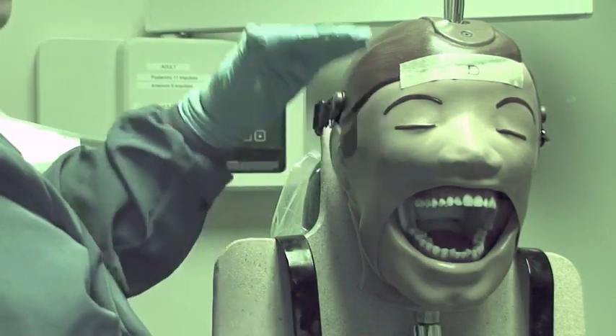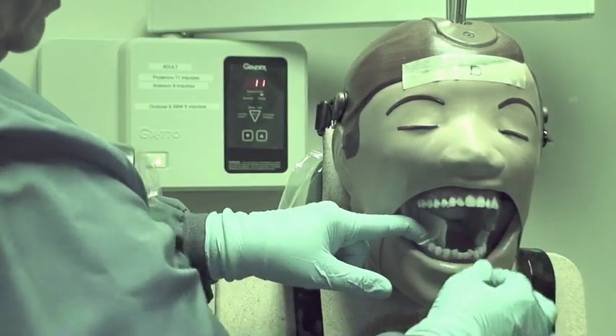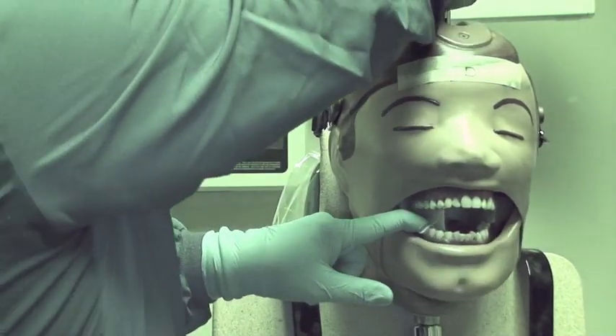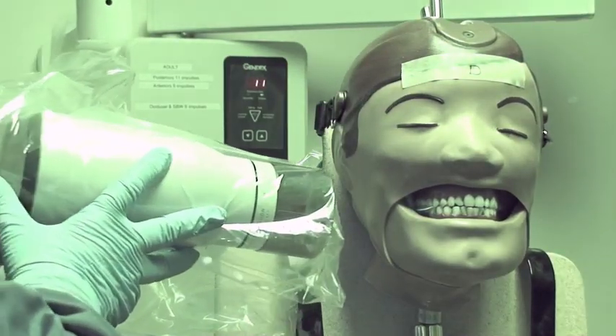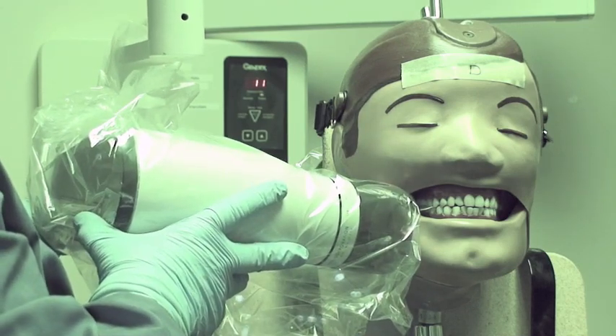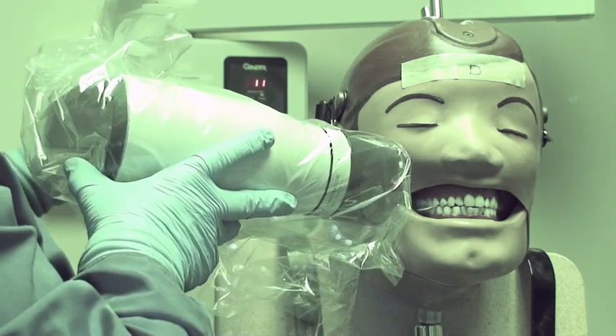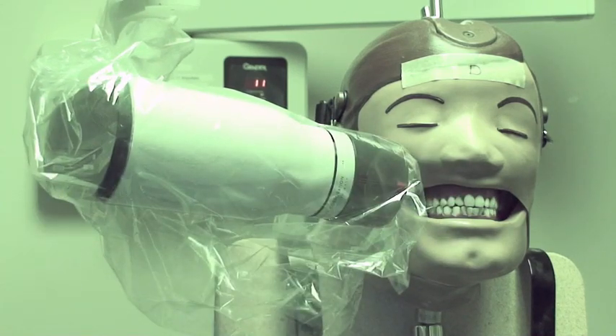You have your patient's tragus line aligned parallel to the floor. Set the front of the film at the mesial of the second premolar. Have them bite in order to get the distal of the last molar. Then aim between the first and second molar with a 10-degree angulation. Check that you're centered over the upper and lower arch at the occlusal plane.